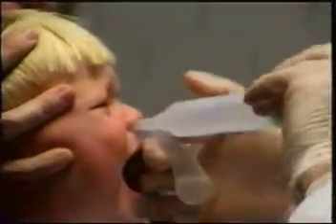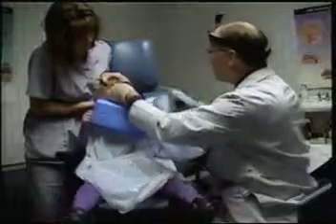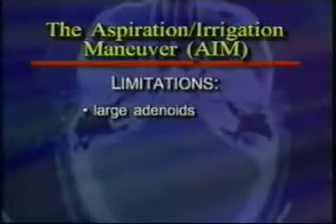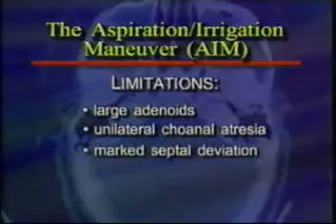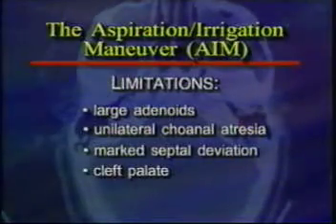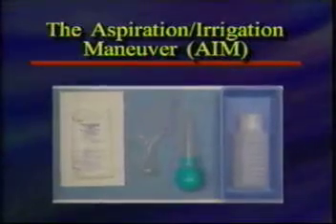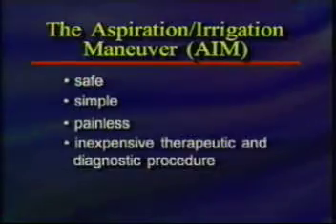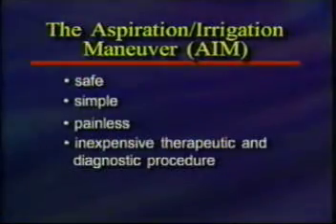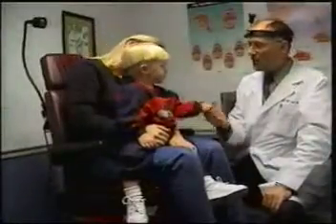The limitations of this procedure are the occasional uncooperative 4 or 5-year-olds and children with large adenoids, unilateral choanal atresia, a marked septal deviation, or a cleft palate. In conclusion, the aspiration irrigation maneuver is a safe, simple, painless, inexpensive therapeutic and diagnostic procedure with many uses in the treatment of acute and chronic sinus disease.